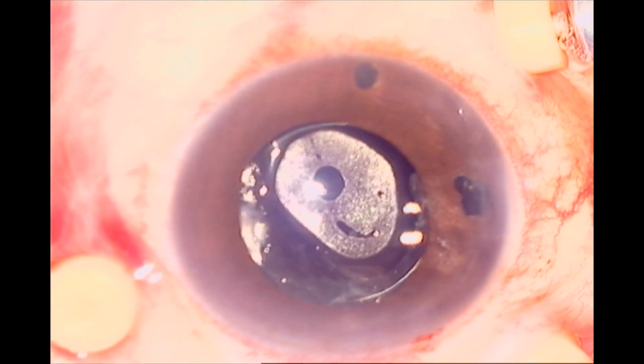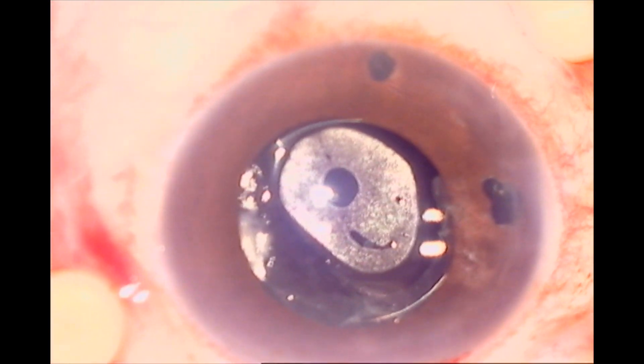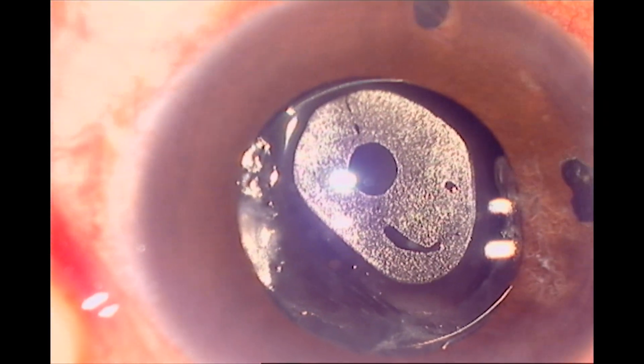During the fluid-air exchange, as you can see, the media becomes hazy. The reason for that is a common problem we encounter in such cases: condensation of water droplets and air bubbles on the intraocular lens, resulting in fogging of the posterior surface of the lens.